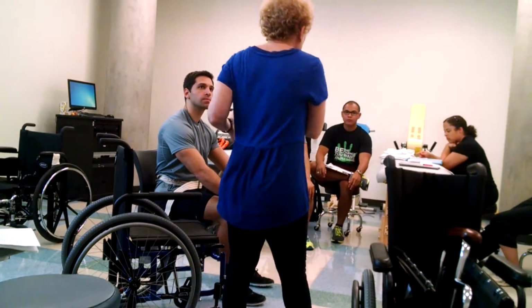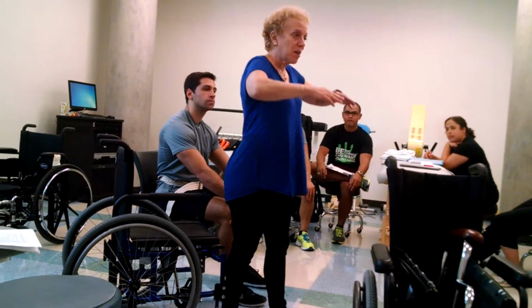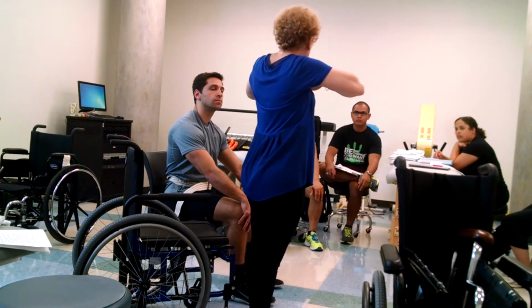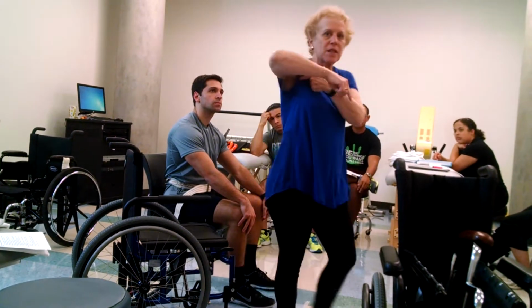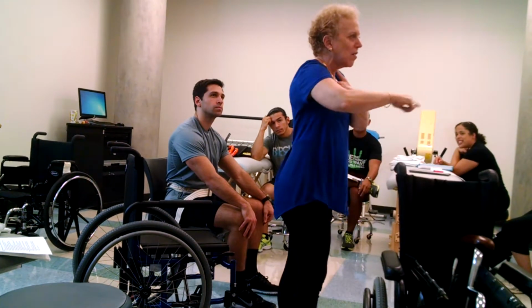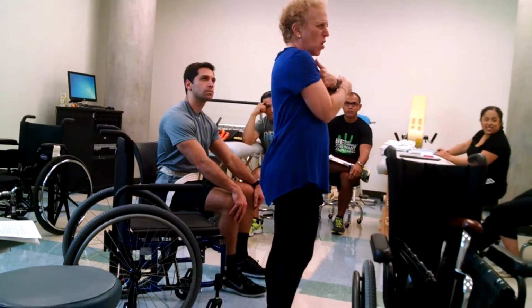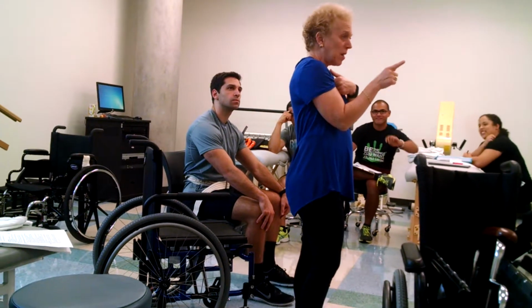Okay, but where we put the gait belt on the patient, sometimes you'll see them put the gait belt on the patient right underneath the armpits. What's in the axilla? The brachial plexus. Do you want to put compression on the brachial plexus? No. So, not a big fan.